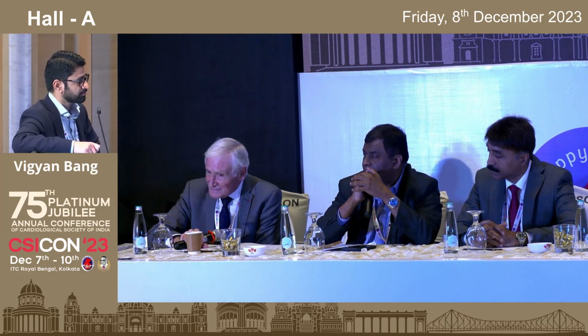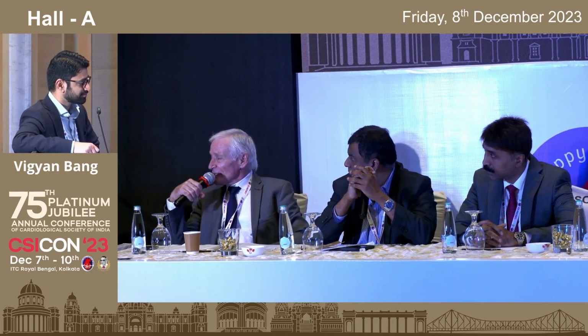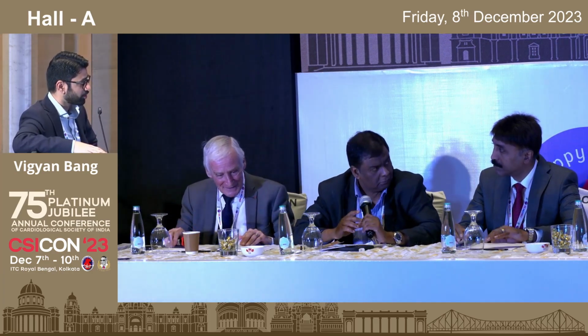Do you? Even if there's, say, VTCs? Because I don't know, and I never, especially when you have to do a post dilatation. More generally speaking, I think we can say that surgeons today should avoid using Trifecta and Mitroflow valves, because most of the problems that we have in valve-in-valve cases are coming from a surgical valve, 100%. And yes, now I think the surgeons have accepted. Yes. And also they can enlarge the aortic annulus before setting the valve inside, and this is good for the future because we have to think, in 2030, what will be the situation. Well, in fact, in the US, Trifecta has been taken off the market for that reason.